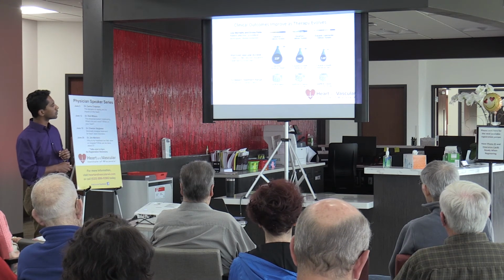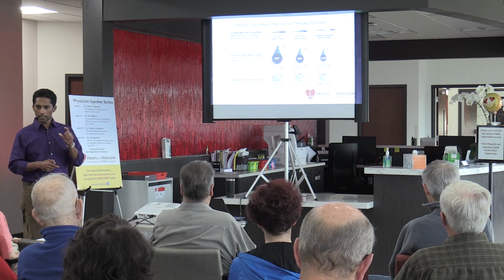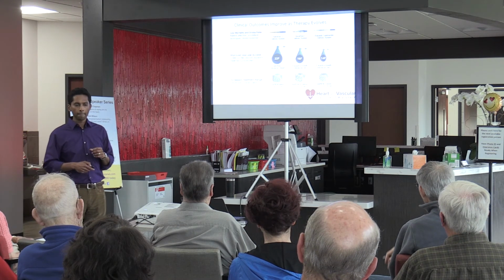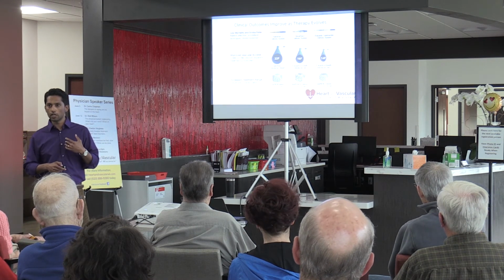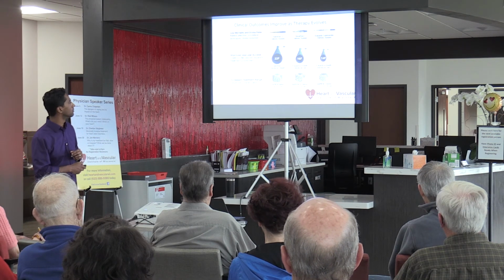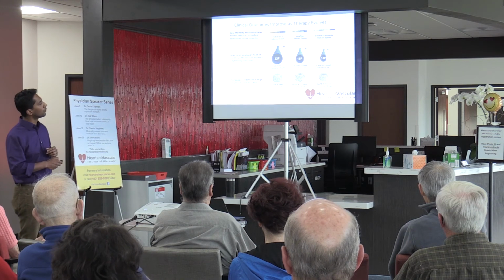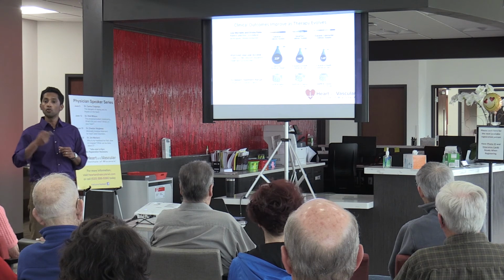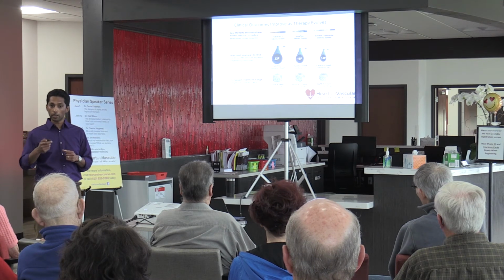So this slide refers specifically to one particular technology, right? It's a valve that's made by Edwards Life Sciences. And so when we started our TAVR program in 2015, we started using the Edwards valve. And what this slide demonstrates is just how different iterations of the valve over the years have improved to allow us to deliver better care, right?